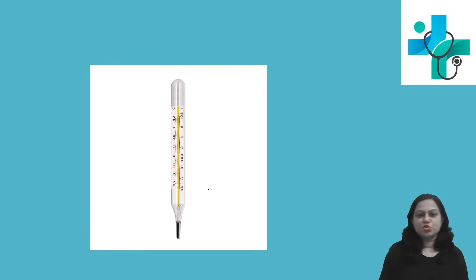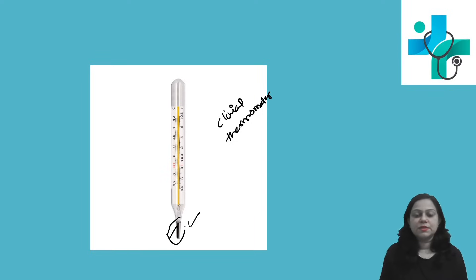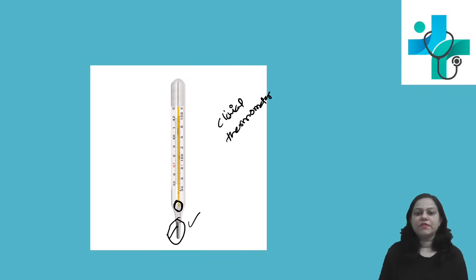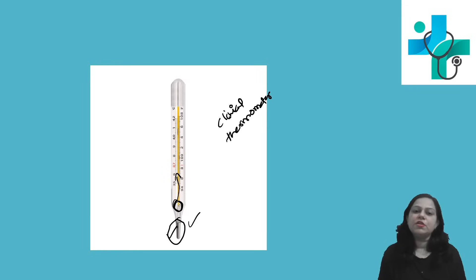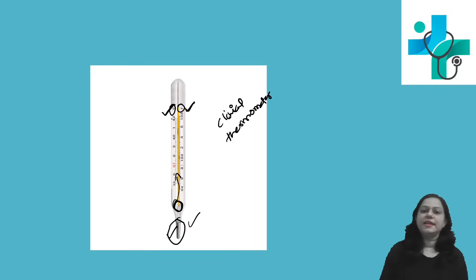This is the instrument named clinical thermometer. See the tip — there is mercury and this is the column. See the kinking here; there is a small kinking which will prevent the mercury from falling down. Whenever you measure body temperature and mercury level goes up, because of this kinking, it prevents the falling of the mercury. See the markings on both sides — one is in degree Celsius and the other is in degree Fahrenheit.